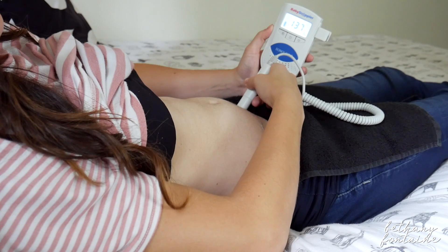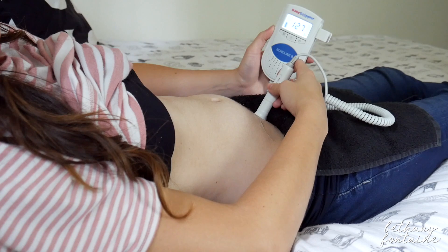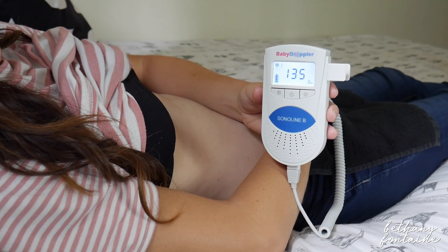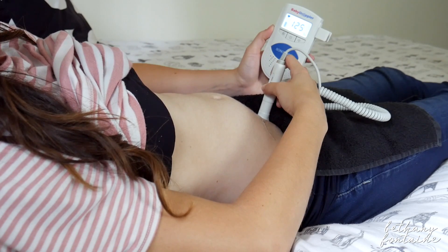You may hear some weird sounds — some swooshing, some gurgling — but when you find that baby's heartbeat, you'll definitely know that you've hit it. You can even hear the baby's movements, and it'll kind of sound like a quick bloop on the fetal Doppler, which is also very cool. It's just great knowing that your baby's moving around in there even when you can't feel it yet. That kind of wraps up this how-to video on using a fetal Doppler at home.